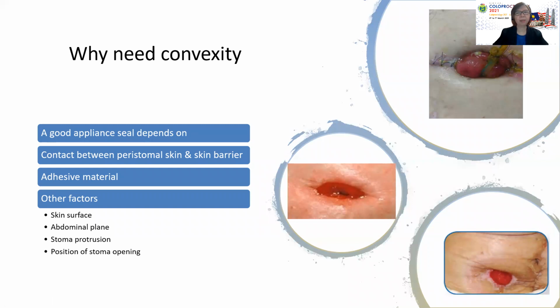So with this, sometimes if you are using a skin barrier that is flat, it may cause leakage from the side here, left and right as well. Because when the patient is lying down, you can see it is already sunken in. What about if the patient is sitting up? The fold will be even deeper, and then the leakage will easily come out to this side and the skin barrier will not last.